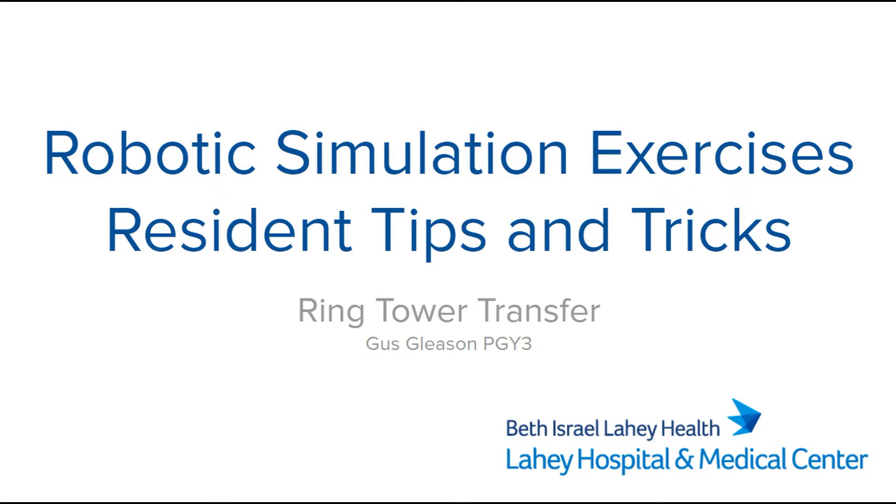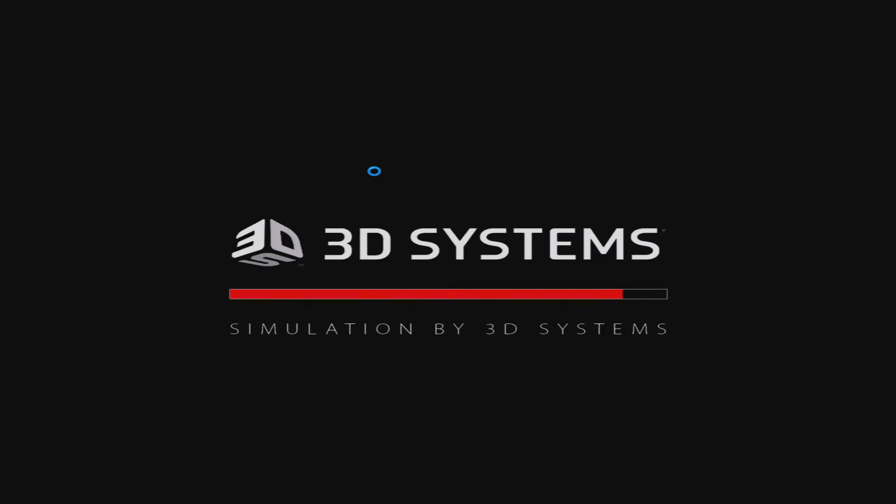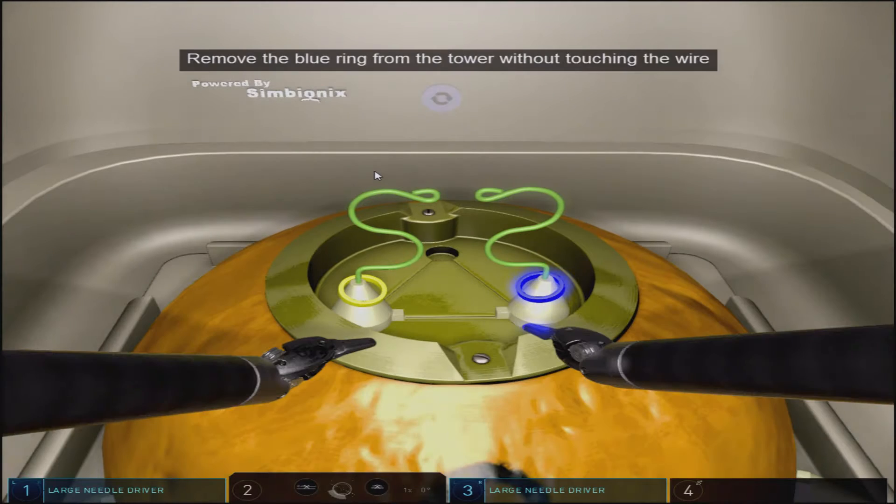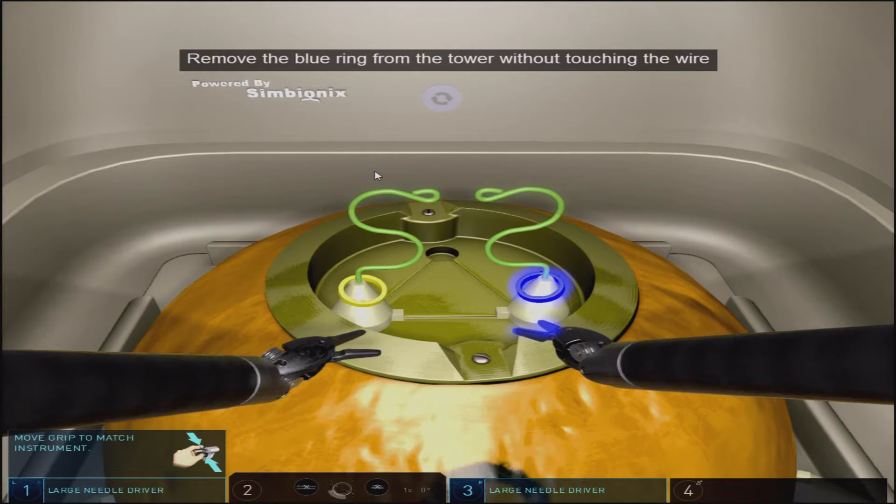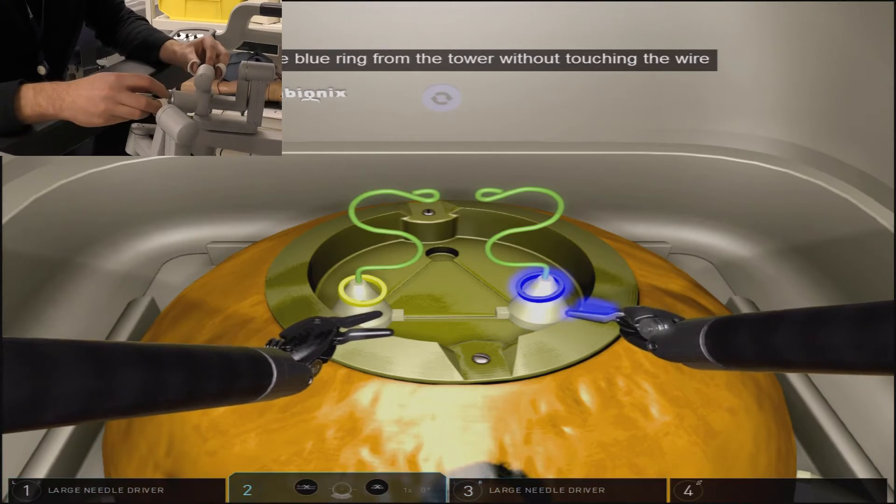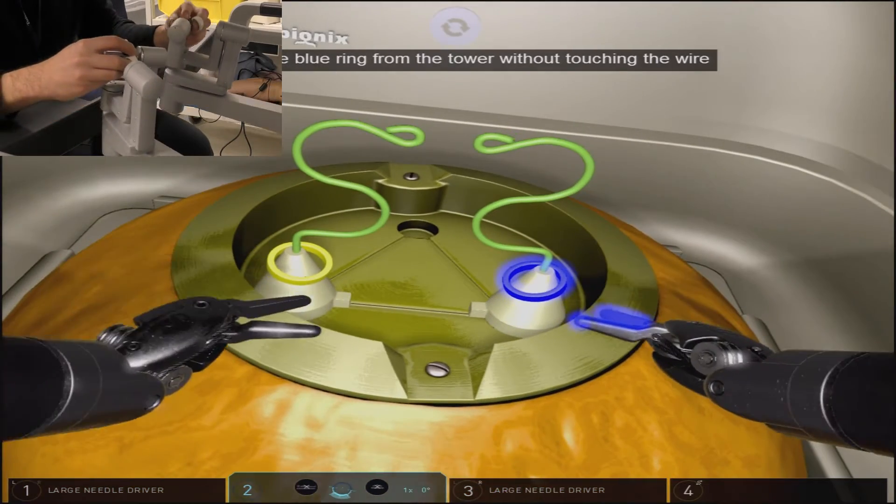Ring tower transfer is another wrist articulation and coordination based exercise, and is actually one of the exercises developed by the consensus FRS or fundamentals of robotic surgery team.